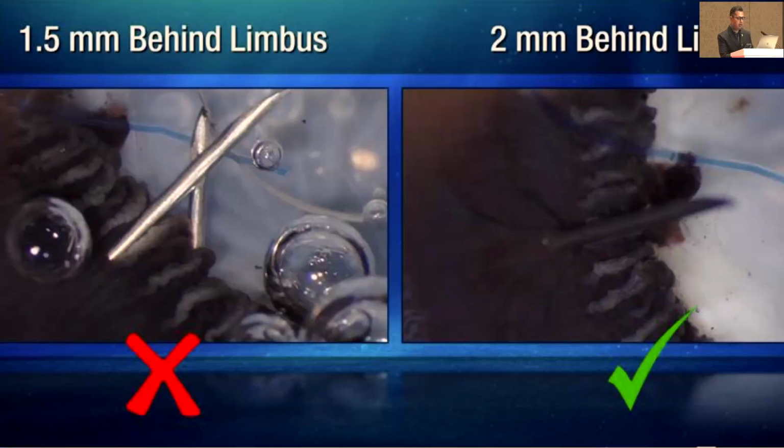As you can see over here in the cadaveric eyes, this is 1.5 mm from the limbus, and you're straight through the uveal tissue. And at 2 millimeters, generally you tend to avoid the uveal tissue and you get into the lesser inflammatory part of the eye, where the eye is supposed to be more quiet. But that also means the IOL is going to fix so much more posterior from the iris. And again, it is very difficult with these bag fixation 3-piece lenses, because they're meant for anterior fixation, so the haptics are not that long.